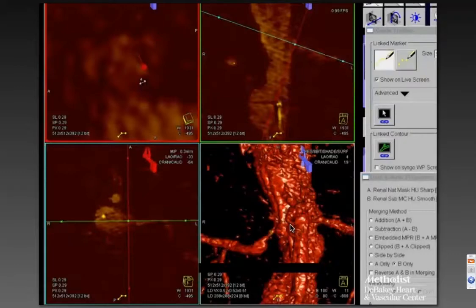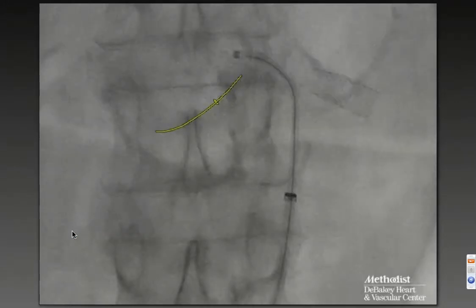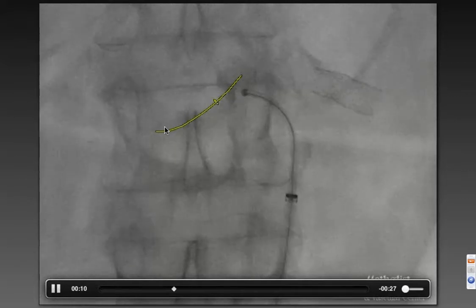What we did was a 3D acquisition. You can see us setting up the rotation for the image intensifier. This is our multi-planar single field view on the workstation, and when you blow that up, you can actually see why this is fairly complex — there's heavy calcification around the origin of the renal artery, and a fairly tortuous little flow pattern. We mark the origin on the workstation and draw a line — the same line John showed you — indicating the trajectory of where you want to lay in your wire. That line is projected back onto the fluoro. The little round circle is the origin, and here's the direction we want to get that wire.